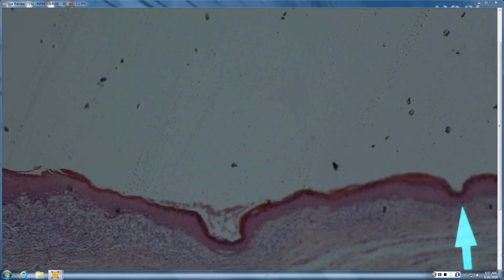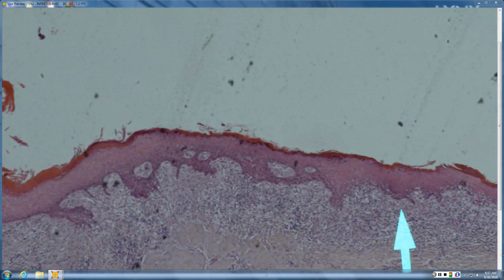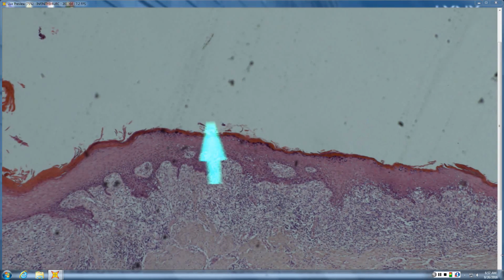So let's get in a little bit further. And so once again, you can see there are some things that are very odd that would go against this being psoriasis. First, there isn't really marked production of the stratum corneum. This is more of a compact orthokeratosis. There's probably some para in there as well, but you're not seeing thickened confluent parakeratosis. There's likely no neutrophils in that stratum corneum. We'll check here in a second, and if there may be just a handful, maybe because there's secondary impetiginization or something. So no confluent parakeratosis, no neutrophils.